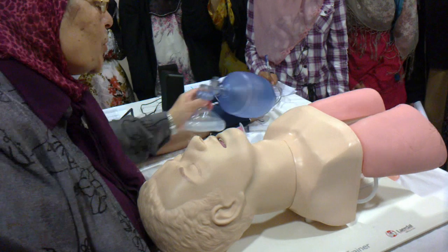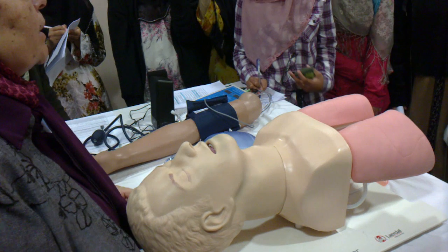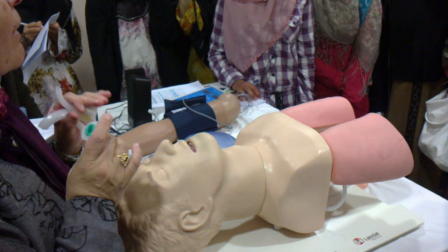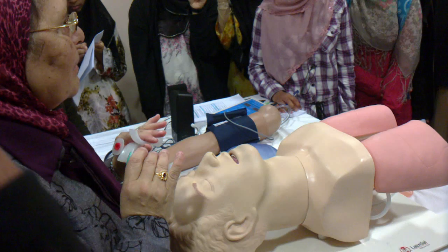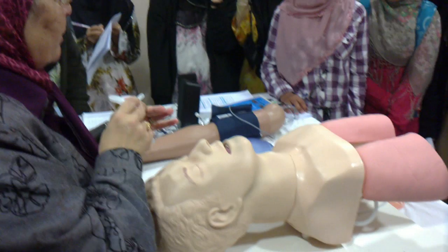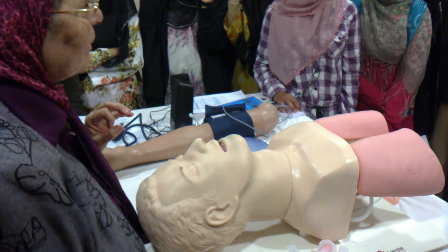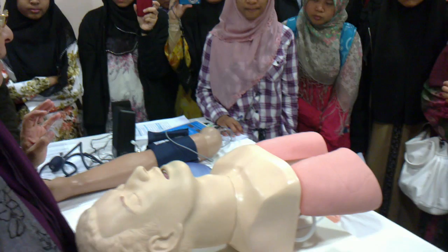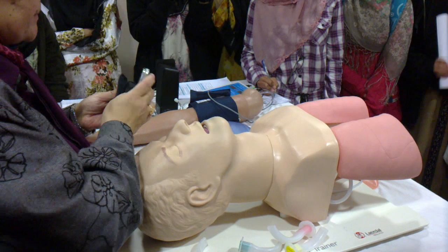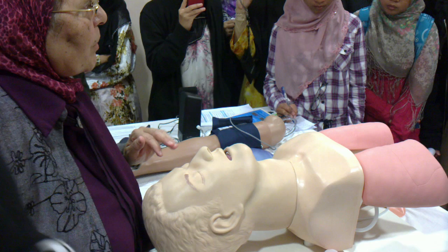Third question is, insert an oropharyngeal airway. You have different sizes. First of all, you have to choose the correct size, the suitable size. Don't rush and take the color you are accustomed to put. Okay? You have to choose the exact size. Sizing is by length, from the angle of the mandible to the incisors at the angle of the mouth. Okay?